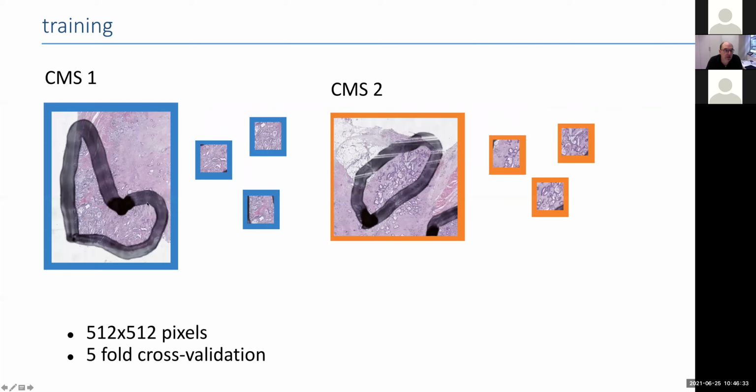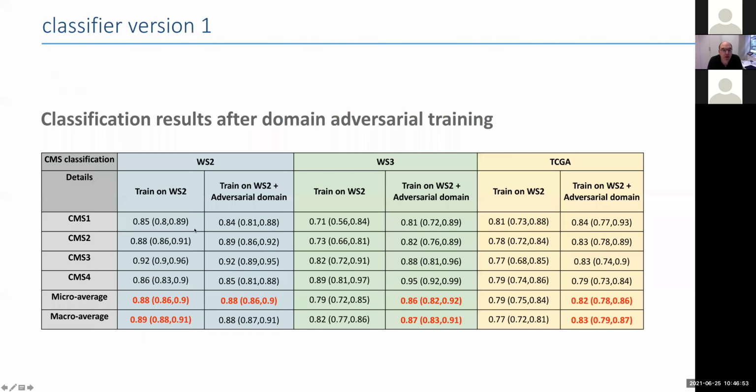We basically here the tumor area is annotated by pathologists by hand. This has now been subsequently automated, but here the entire tumor area is used for sequencing, so we don't really know which of the tiles belong to what class. We only have basically one class label.